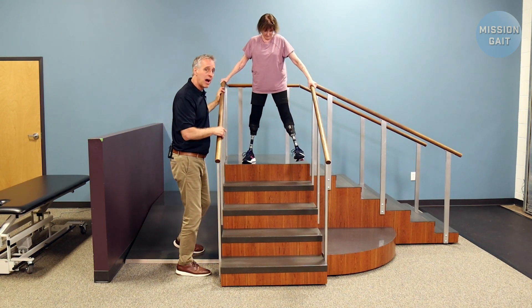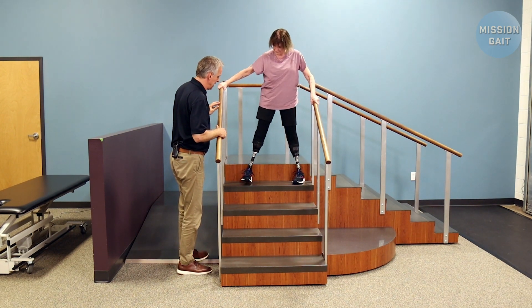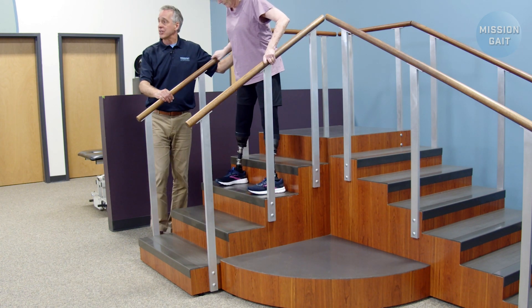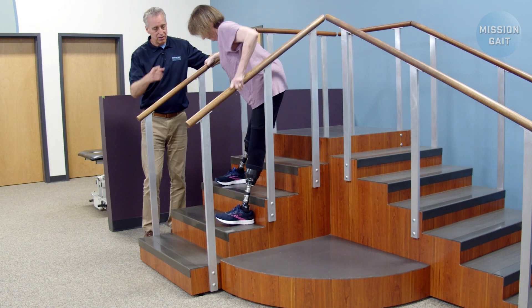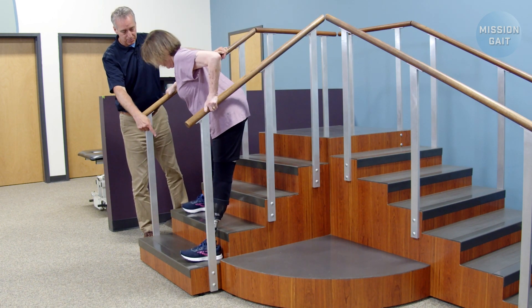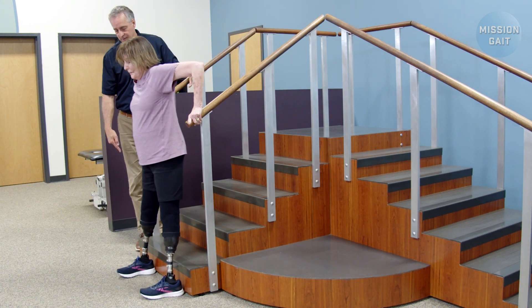Coming down, it's basically the same process. She has to give herself room — to keep her knees locked out and be able to shift her hips. Notice how much hip action is going on here, holding on to the rail for stability. Try not to bend that knee — so you lift it up to step it off. Excellent.